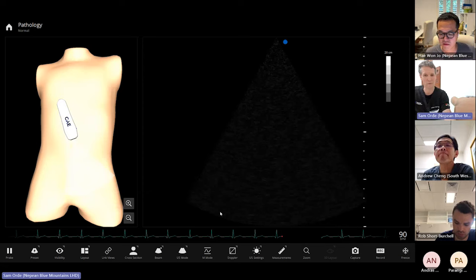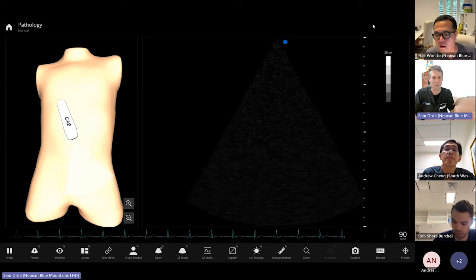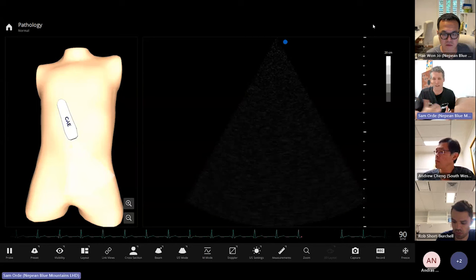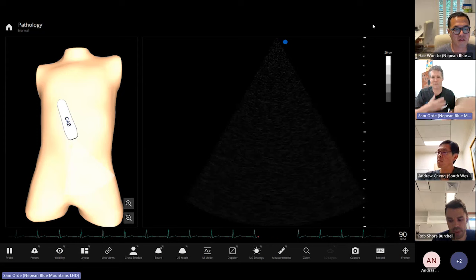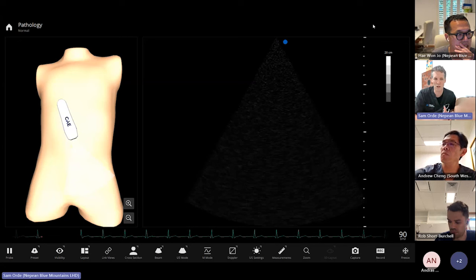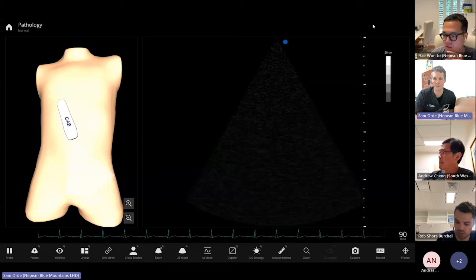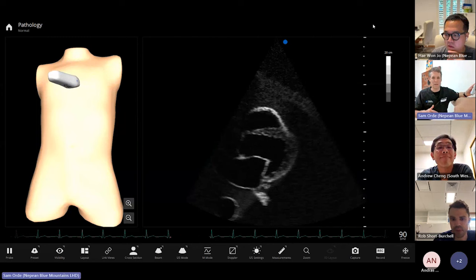Thanks everyone for joining. We're going to go through how to do a full echocardiography study. We're starting off the year of teaching, and I thought it might be useful to do a session on how to do a full study, since a few of you are starting off on your logbooks. For the DDU, knowing how to do a full study is extremely important. I'll take you through how I do it — it was taught to me by sonographers, and most people tend to follow this pattern.